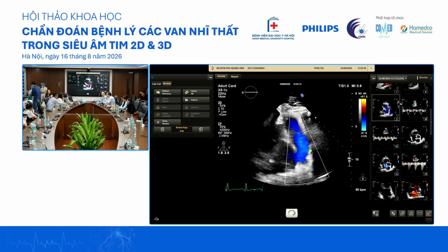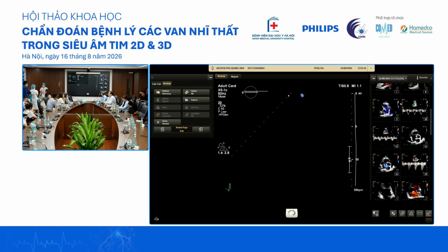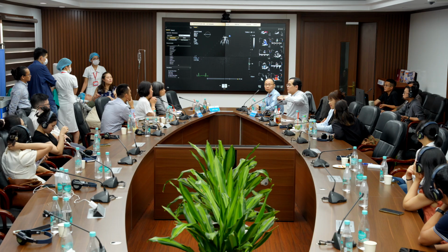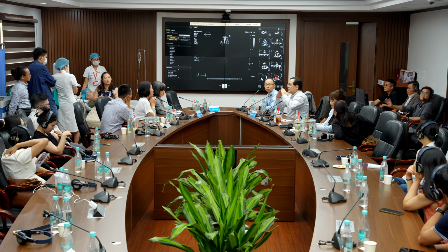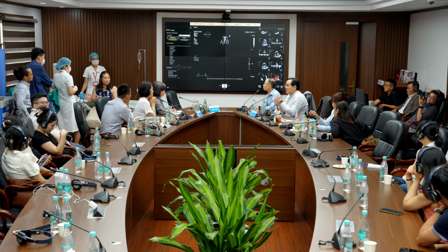So one thing I want to add to what Professor Raymond Wong commented is, this is truly a ventricular functional tricuspid regurgitation, because the valve coaptates in this position rather than flat. Flat would be atrial functional tricuspid regurgitation, but this way it's ventricular functional. And then the jet is central.